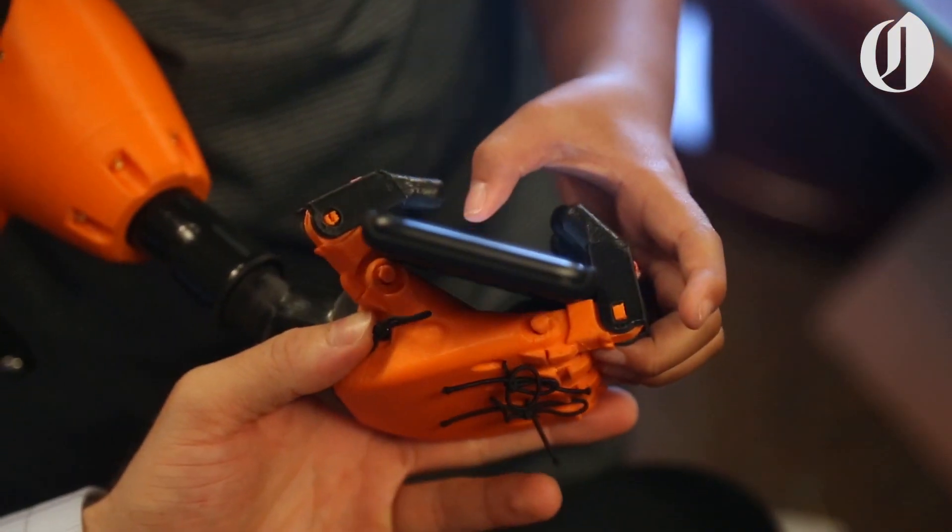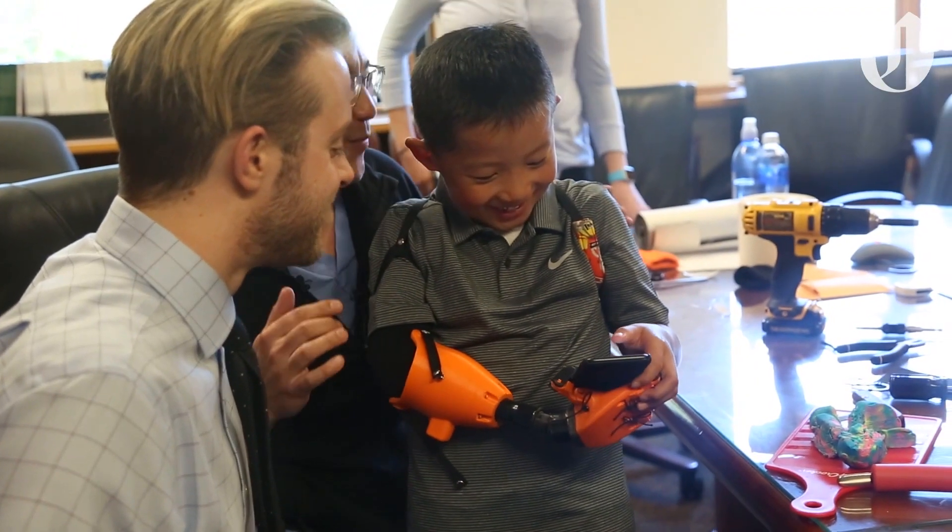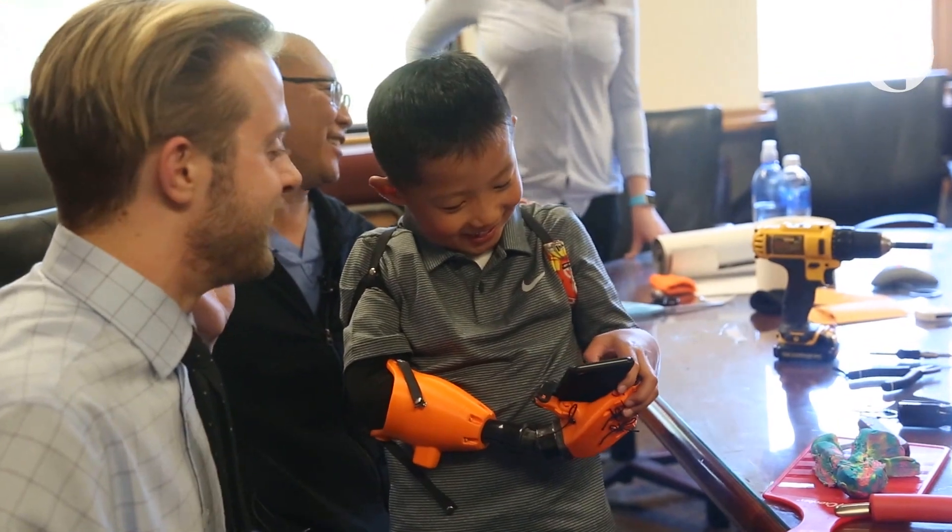It's unique in the fact that it has free range of motion at the shoulder and elbow, and it has a rotating wrist, which has never been seen before.